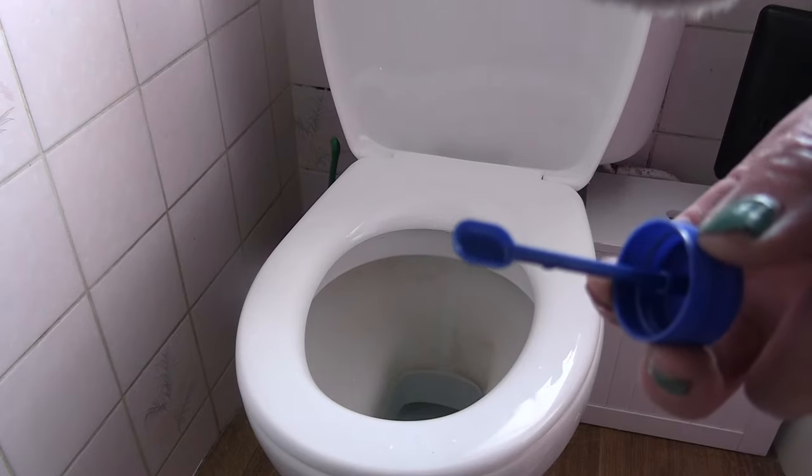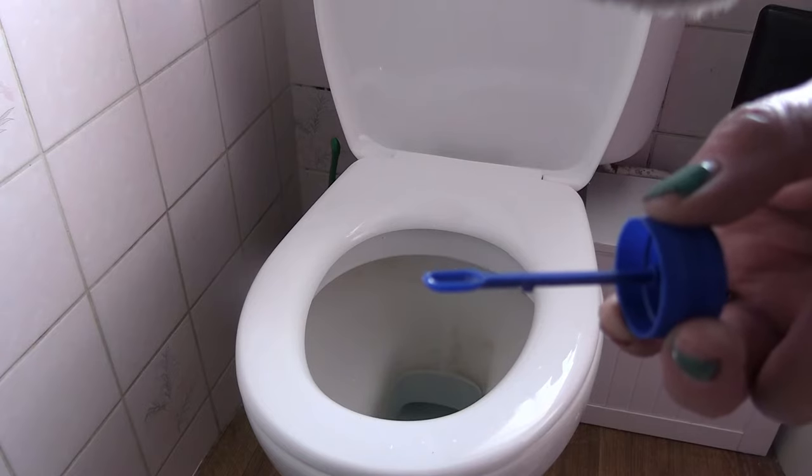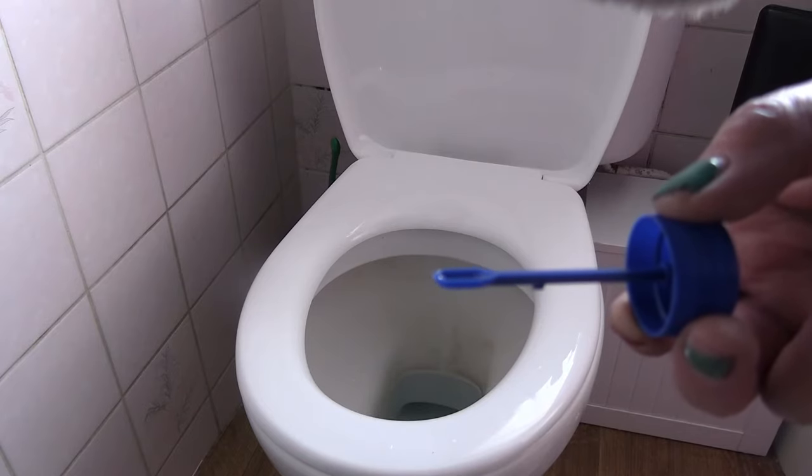It's got a scoop on the end. Yes, you really do scoop your poop. But it's actually not as bad as you might think.